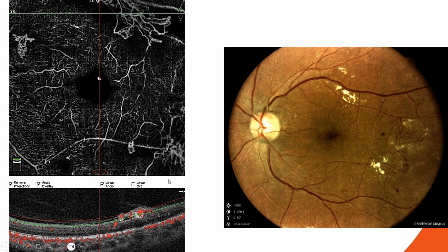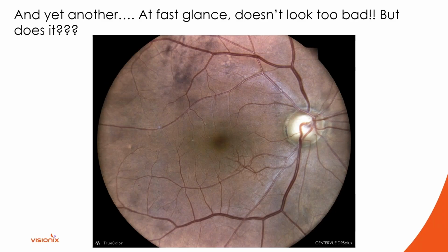And, you know, if you're paying attention and looking back and forth at the fundus image, it's not as clear on the fundus image as it is on the angiogram of all of these areas of proliferation. So if you're looking at an image and you're not sure, is it neo, is it IRMA, angiography is going to give you the answer.